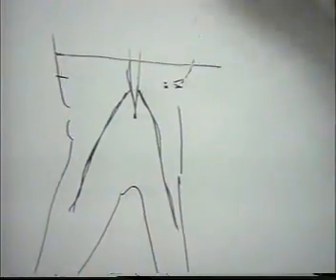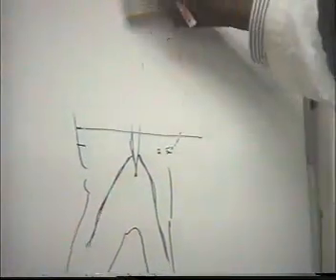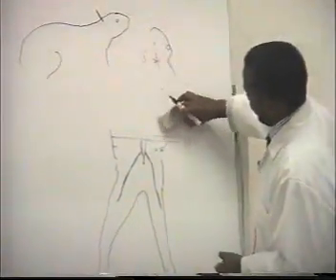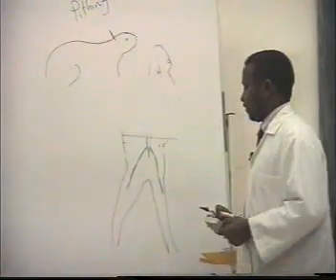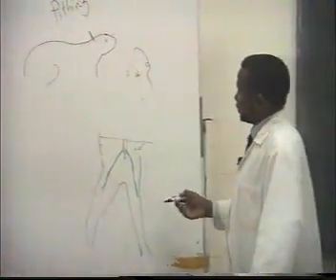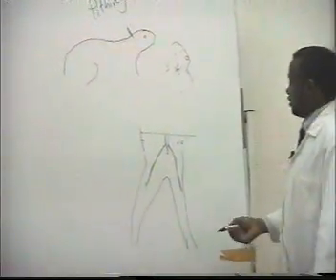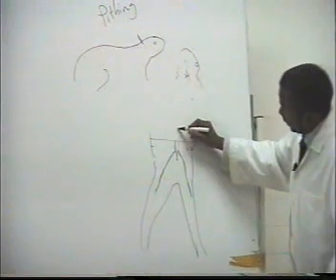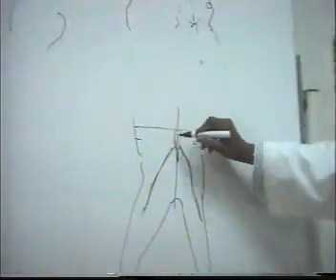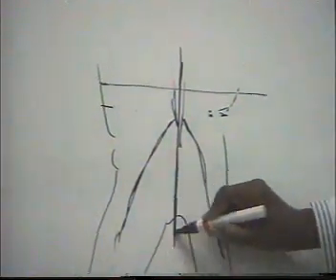Ringer solution is a solution containing sodium chloride, potassium, calcium. This solution resembles the normal body fluids of the frog. So we keep our preparation wet with Ringer solution, and we continue this section by making the cut in the bone at this level until we cut the pelvic symphysis.